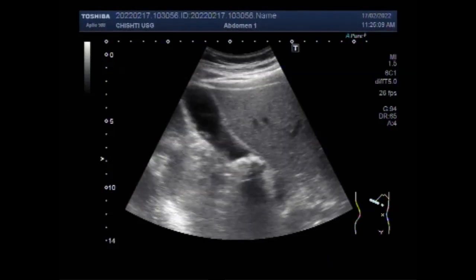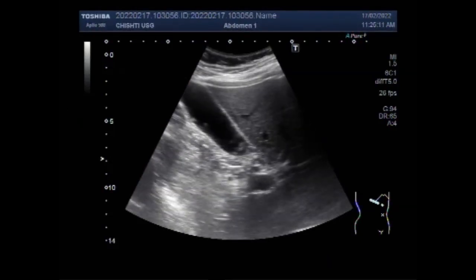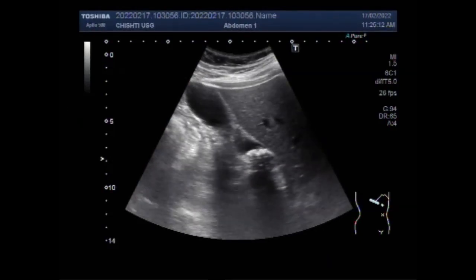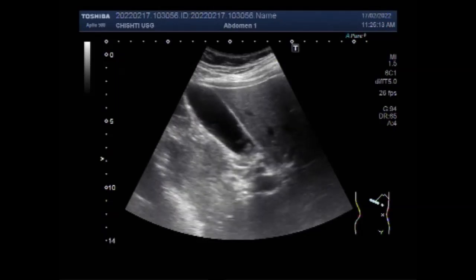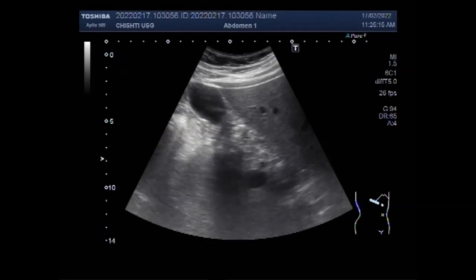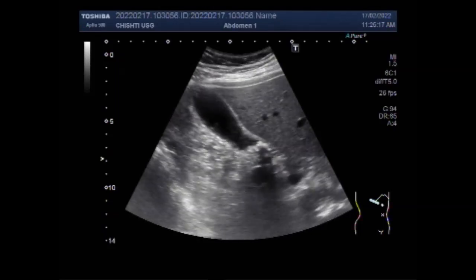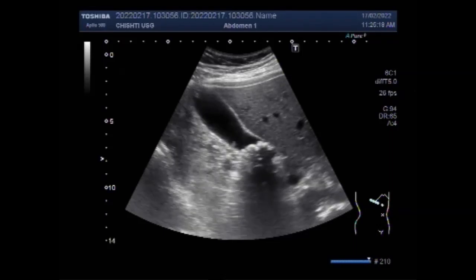Dear viewers, I hope you are all fine. This ultrasound video shows differentiation between the gallbladder stones and polyps, as both conditions are seen simultaneously in a patient.